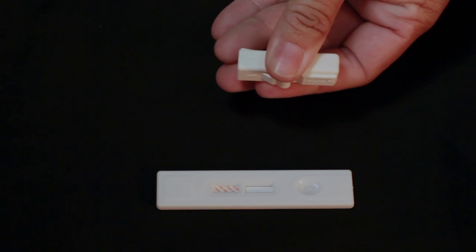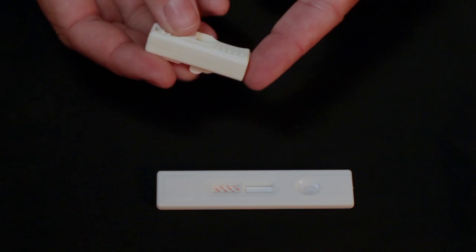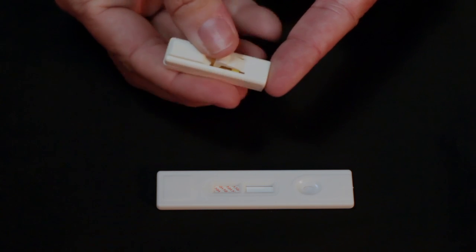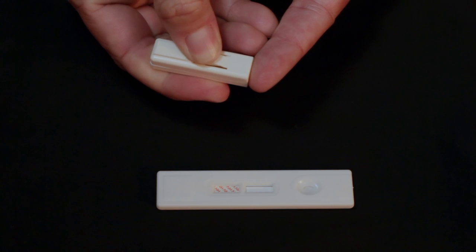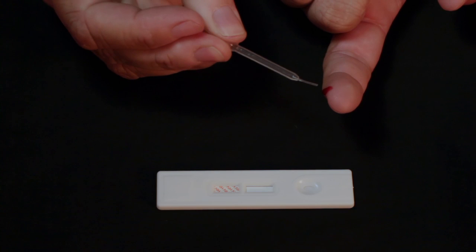The lancet is now ready for use. Press the open end of the lancet firmly against the sterile area of the finger and press the side button to release the needle. The lancet will prick the finger. Gently squeeze the sides of the finger several times to bring a drop of blood to the surface.